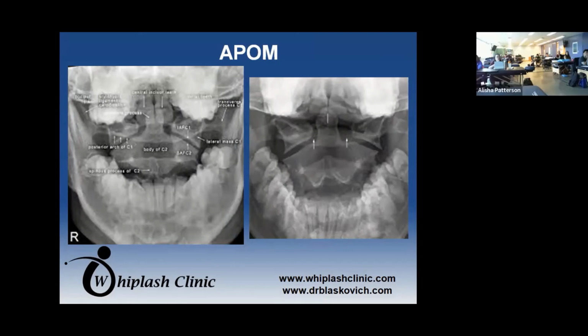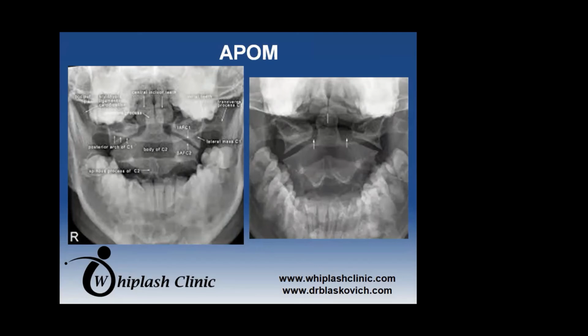Anyone? Dens is tilted, they're saying? There's arrows pointing to the spaces. Yeah. Oh, yeah.